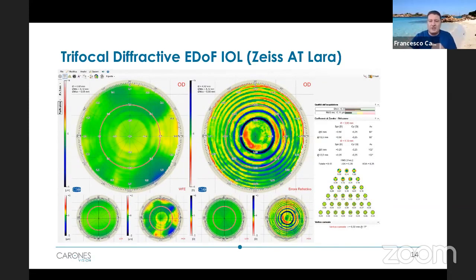And again, if we look at the low order aberration figure of this eye, we see mostly green. There is a little bit of astigmatism as well. In this case, we are in the range of half a diopter of astigmatism, so a very low value. But this total amount of light dispersion bringing plano is given by a huge dispersion of light going in this elongation as we were discussing earlier.